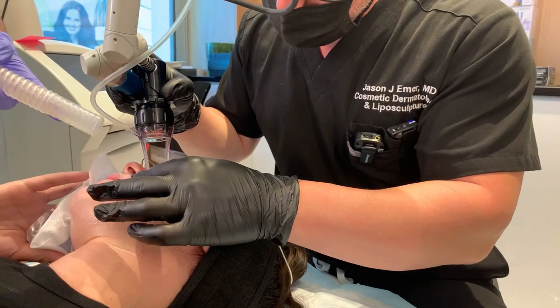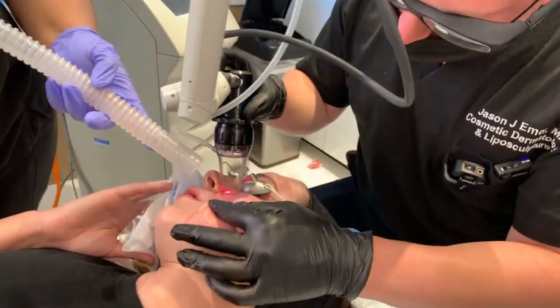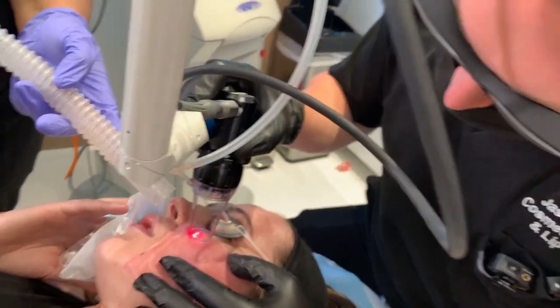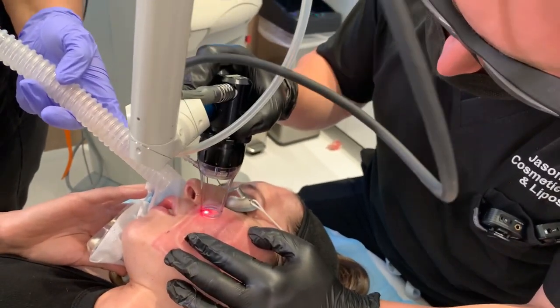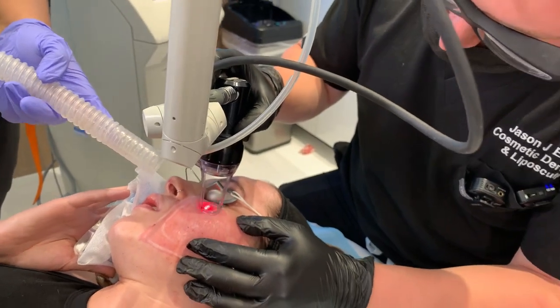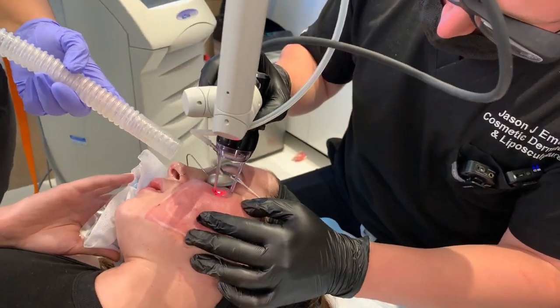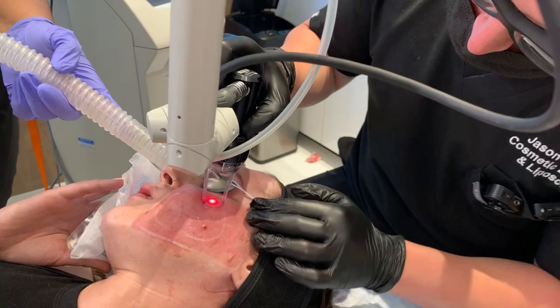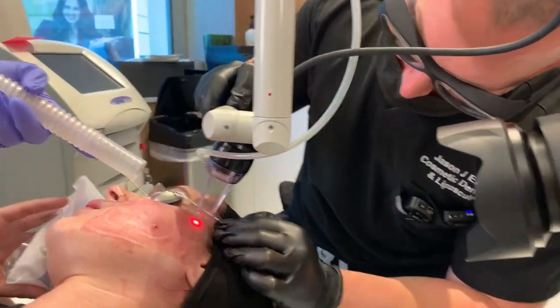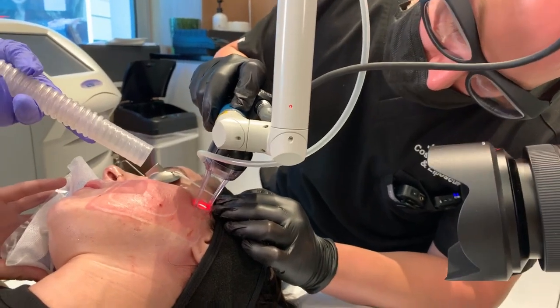My patient here today has done this before. She actually knows what to anticipate, how many days it took for healing, and then she also did a really strong deep setting, which is what we're doing right now. And that is probably why it lasted for so long for her to see this amazing outcome with a lot of transformation in her skin scarring, because this is long-term collagen production.